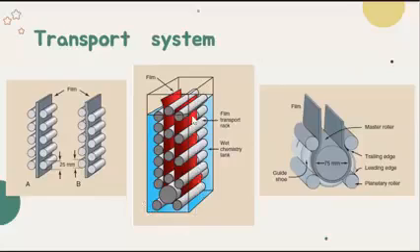which is this one. Okay, this is one transport rack. For each processing tank, there is one transport rack. So in this transport rack, the film enters here, and then guide shoes will guide it back up, and then we'll cross over to the next tank. Okay?